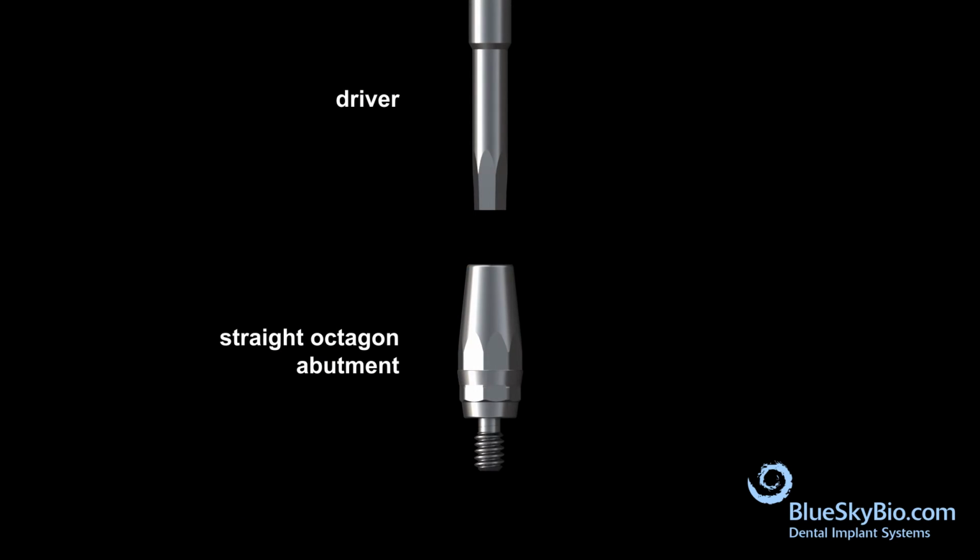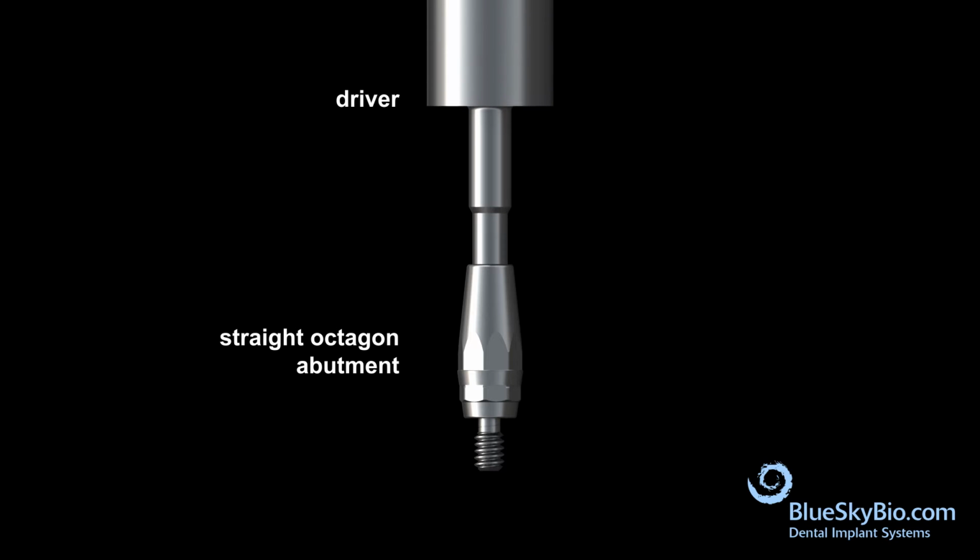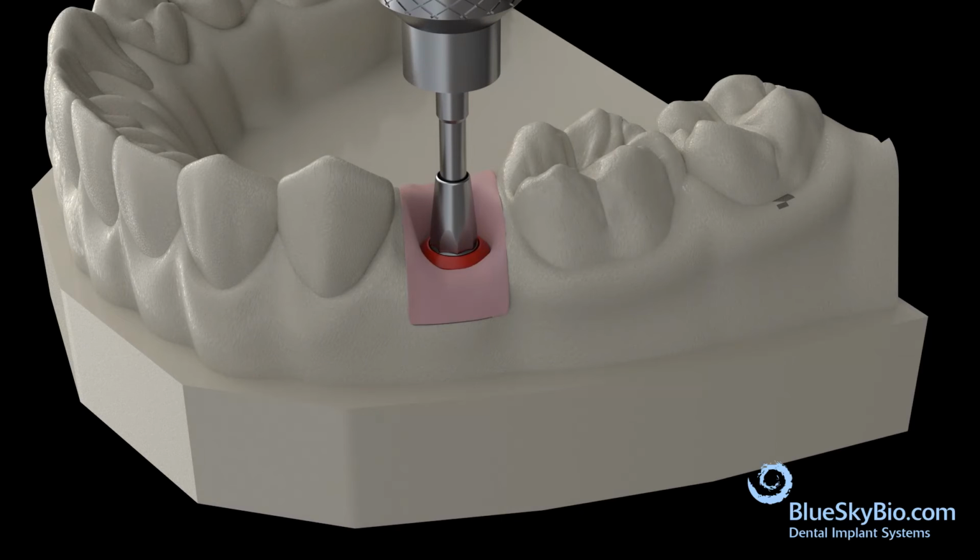Insert the driver assembly into the SYN-OCTA compatible abutment fixation screw within the abutment. Insert the abutment into the implant level analog, making sure to align the male octagon of the abutment with the female octagon of the implant level analog. Determine areas of the abutment that require reduction and mark on the abutment. Remove the abutment from the stone model and place it into an analog.